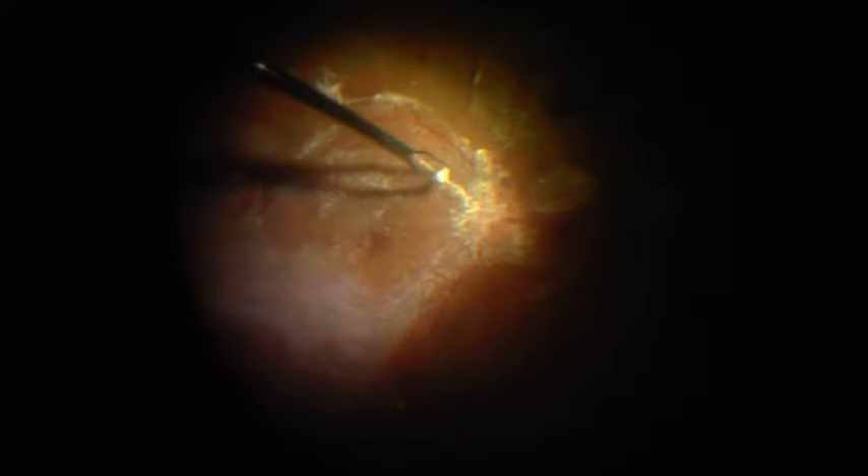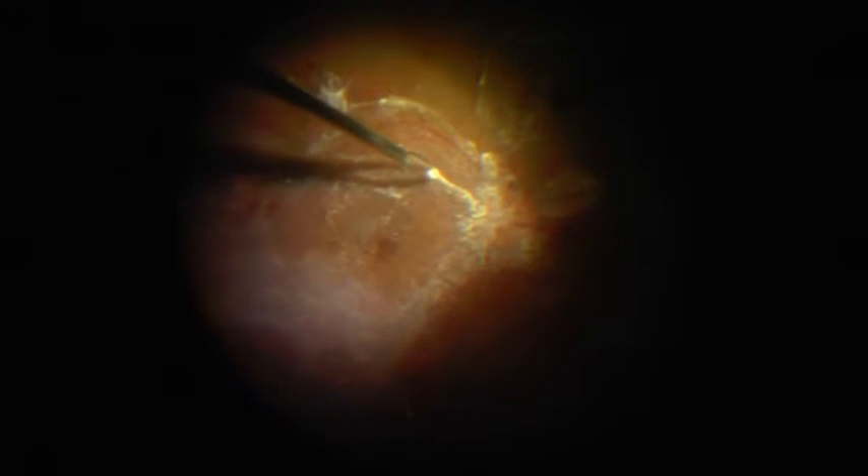Hi, this is Dr. Upsham Goyal. We shall try to demonstrate the versatility of 27-gauge vitrectomy systems in complicated vitreoretinal surgeries. This 50-year-old gentleman was referred as a case of status post vitrectomy surgery for proliferative diabetic retinopathy. He had undergone multiple injections of bevacizumab and lasers even before the surgery.